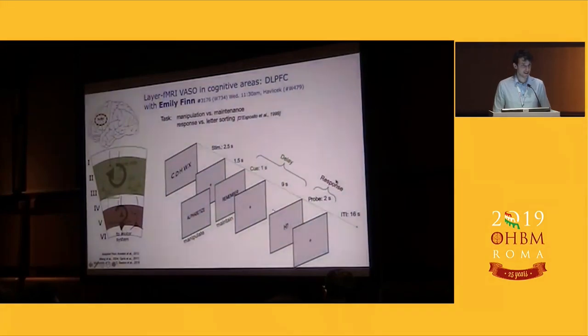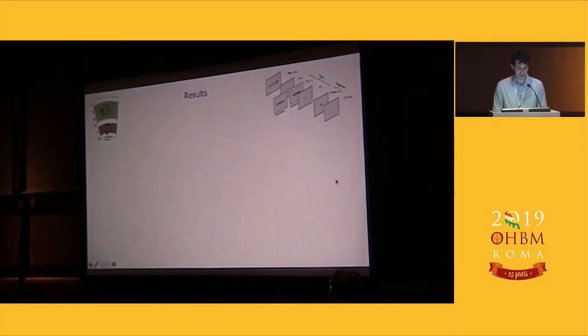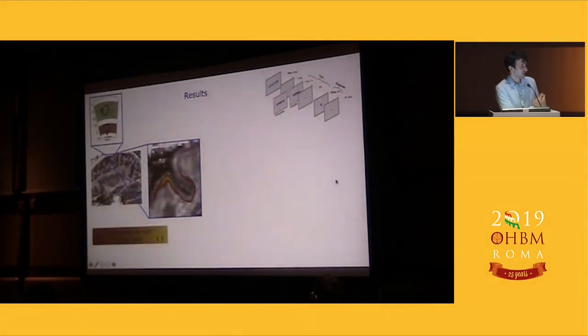And this very simplified microcircuit can really nicely explain all the variance in the data that we are getting here, zooming into a CBV-weighted EPI that has this inherent T1 contrast. And you can see that for the response condition, we mostly see activity following the deeper layers along the cortical ribbon here, upon smoothing of 1 millimeter within layers, whereas the alphabetization condition really results in activation parallel to that in the superficial layers.